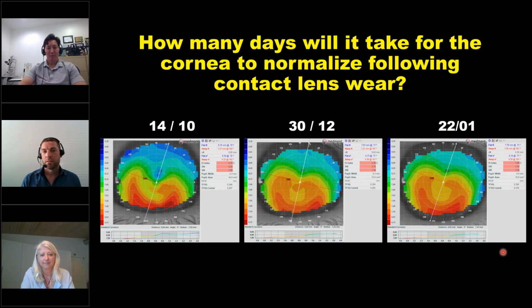I added the slides. This was a patient who inversed a right and left rigid lens, and it took nearly 3 months before I had a quite stable measurement. This person came back several times for measurements, but as long as you're seeing massive changes, it doesn't make sense to start fitting a lens, because you'll end up doing refits and losing time and also money. So it's better to wait to have a stable result in your cornea before attempting to start a new fit. Makes perfect sense.